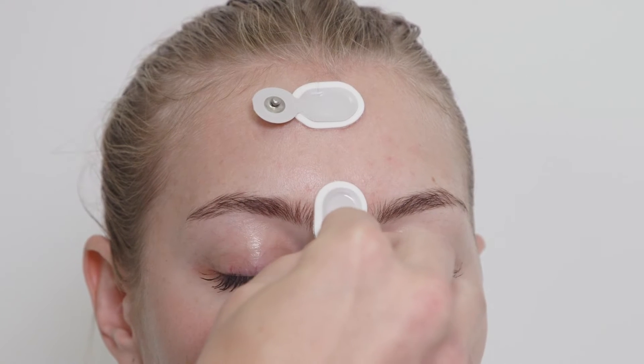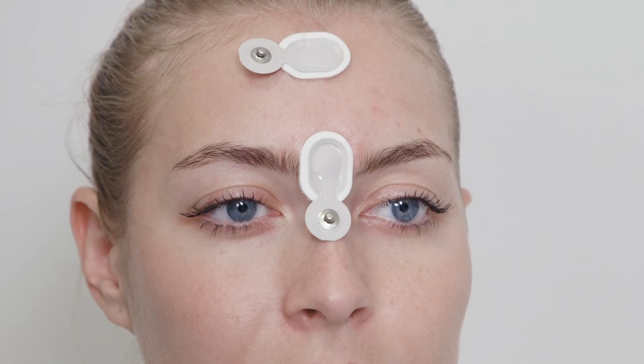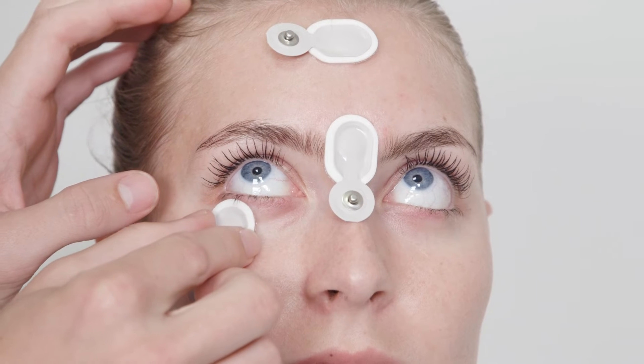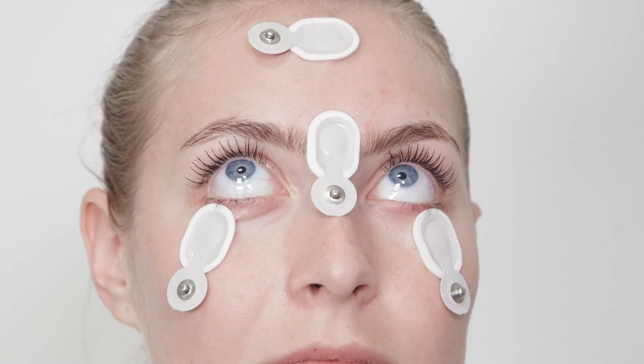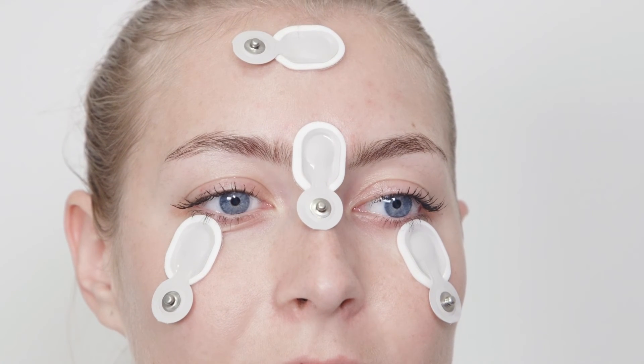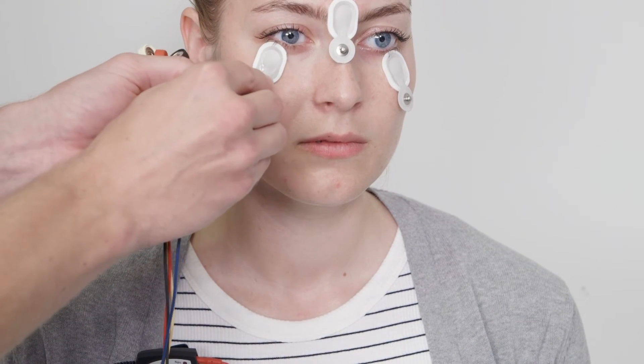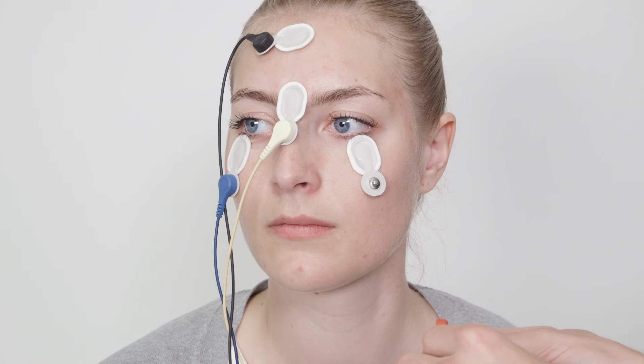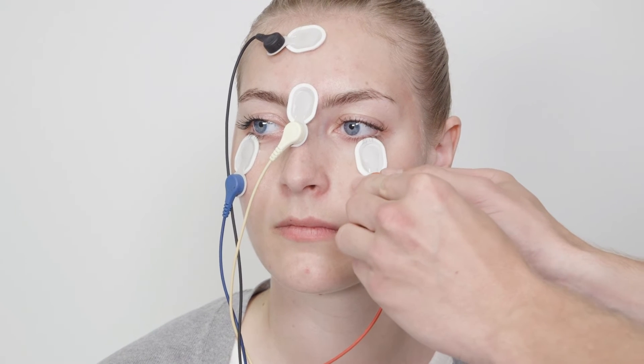Place your electrodes. Mount your cables. Remember, the left cable should be connected to the electrode under the right eye, and the right cable should be connected to the electrode under the left eye.